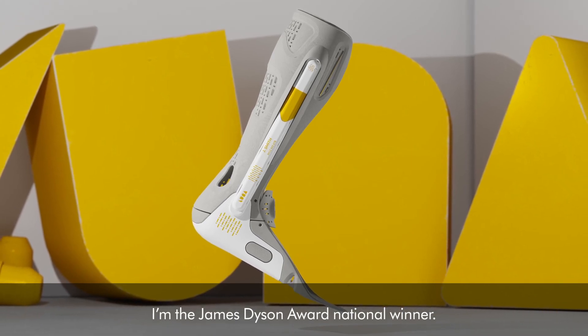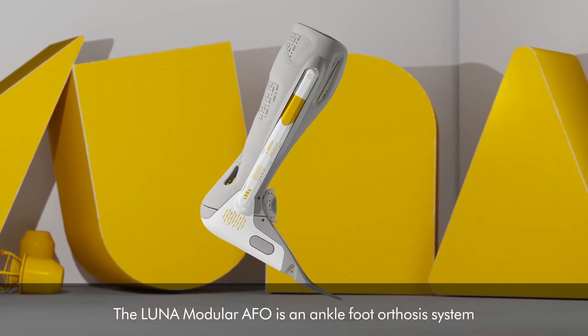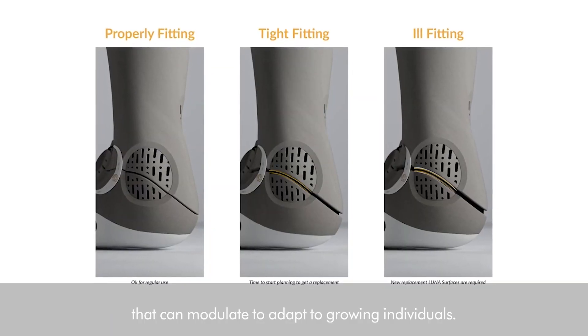Hi, my name is Aaron. I am the James Dyson Award national winner. The LUNA Modular AFO is an ankle foot orthosis system that can modularly adapt to growing individuals.